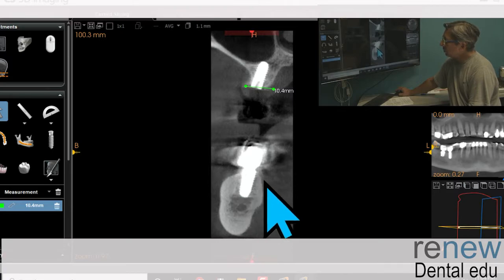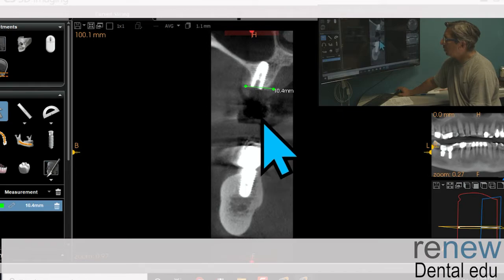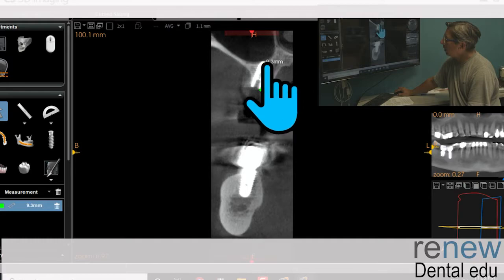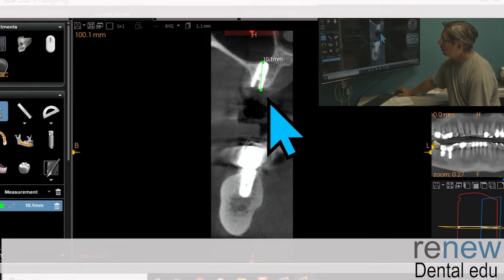It may be just coming off the top thread there now, but very well placed above the nerve. Very nice width, very good compressive loads on both. A little bit of an angulation. I would like to see that a little bit straighter, possibly more this way, but I get how it ends up that way, especially on number 14. You tend to have a little bit of an angulation problem, but that would be a little bit more ideal of a placement, but otherwise very good.